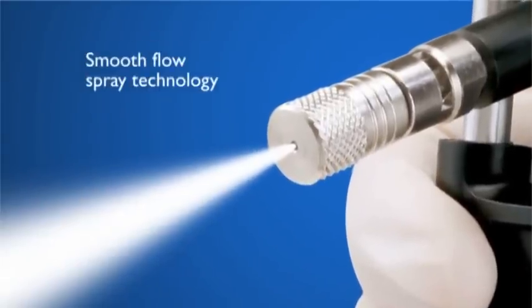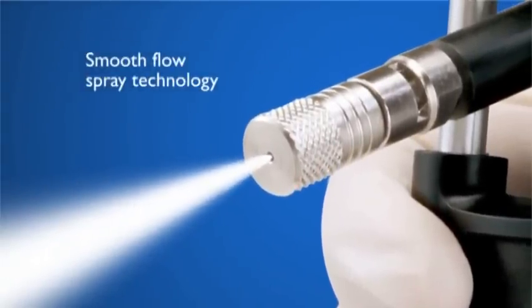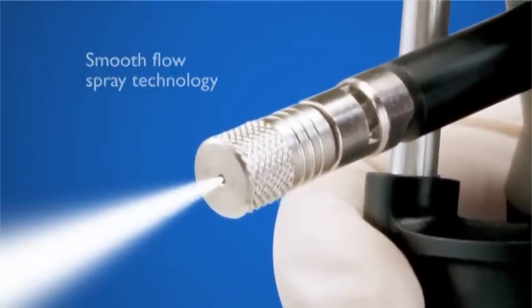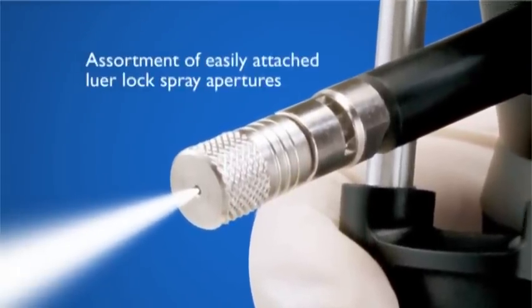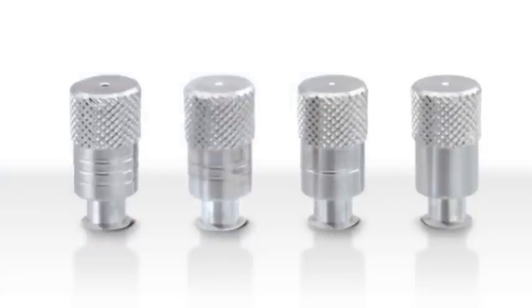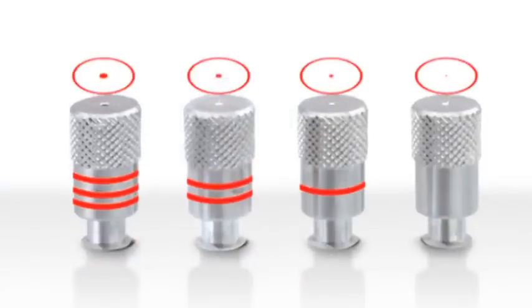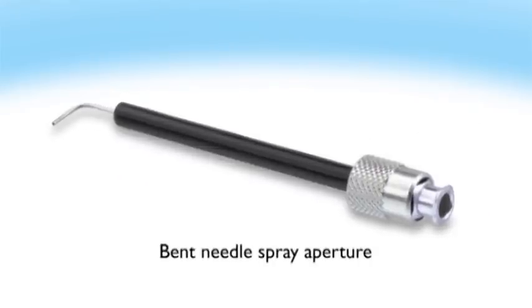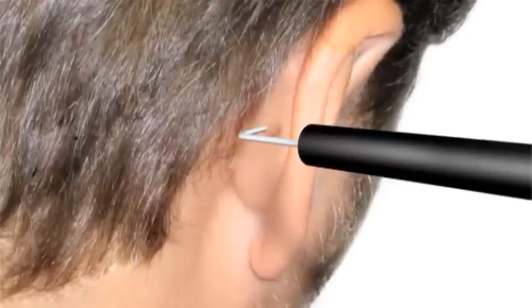UltraFreeze's Smooth Flow Spray technology ensures that a controlled spray of liquid nitrogen is delivered to the treatment site each and every time, through an assortment of easily attached luer lock spray apertures that come with the system. The rings on the shaft of the spray apertures help distinguish the size of the aperture opening, ranging from 16 to 22 gauge. A bent needle spray aperture is provided for those hard-to-reach areas.